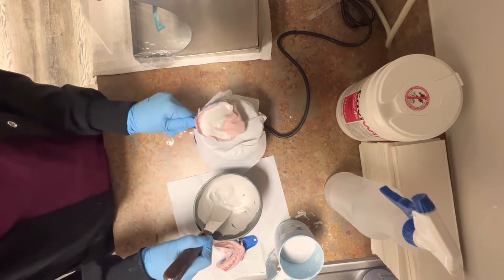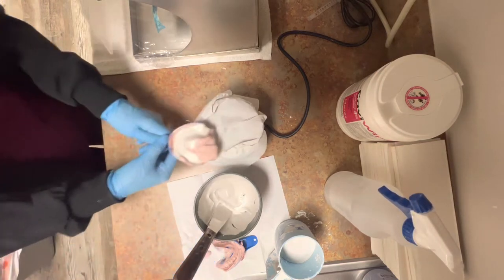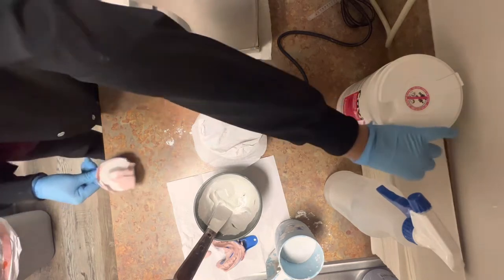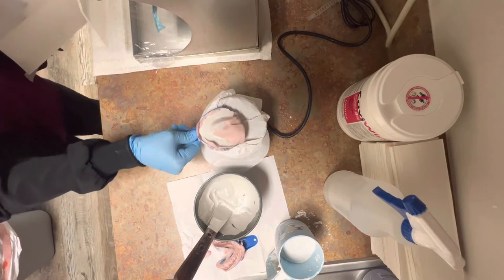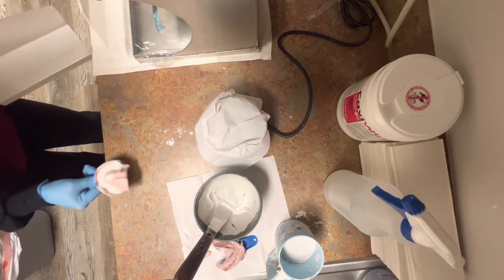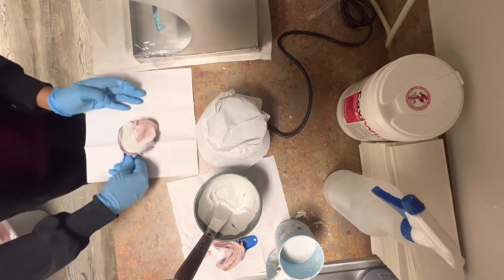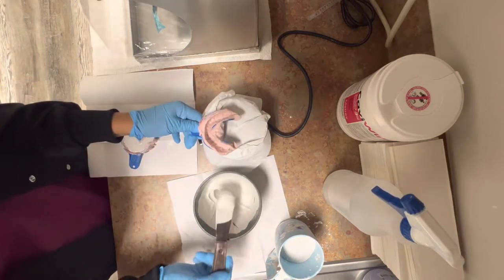I do this trick where I tap the impression. I'm going to take it off the vibrating machine and tap it, and that usually helps eliminating some air bubbles that I see. So after that one layer, I'm just going to set this aside and do my lower arch.